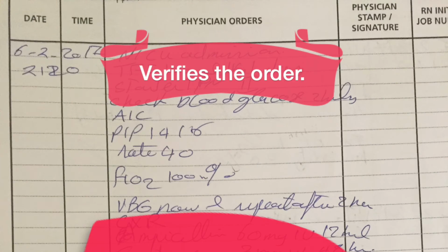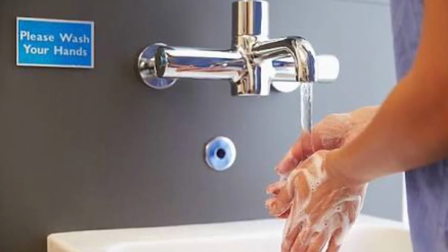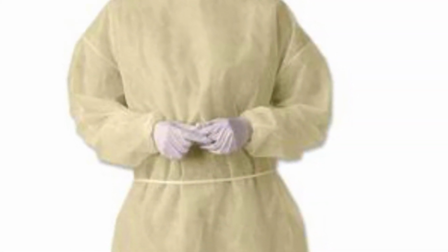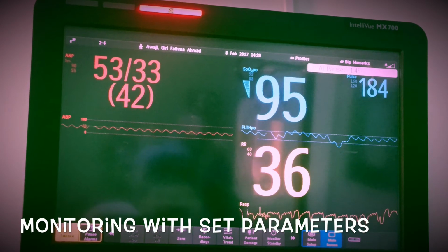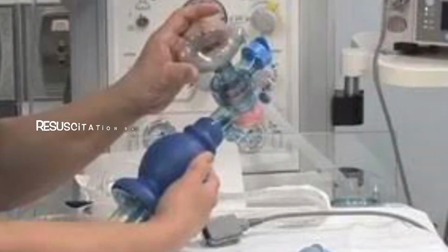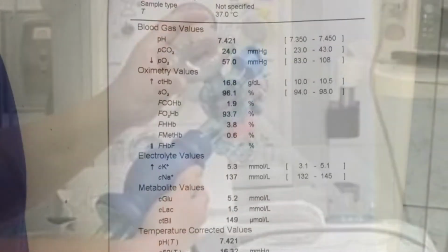To begin with, you have to verify the physician order and identify the patient correctly. Perform the correct sequence of hand hygiene. Wear appropriate PPE. Check that alarms on the ventilator and bedside monitor are within normal limits, and monitor pre- and post-ductal saturation for patients with PPHN. The resuscitation bag and mask should be ready and connected to an oxygen source.